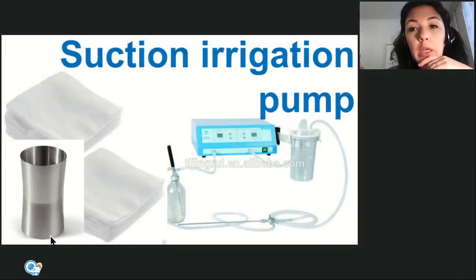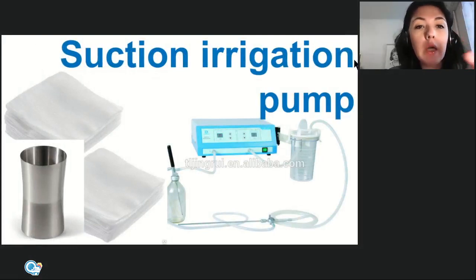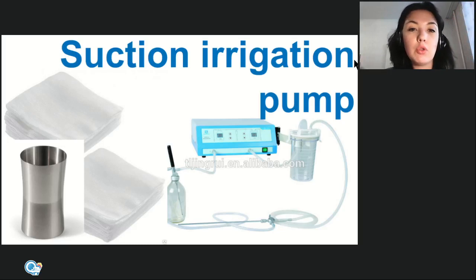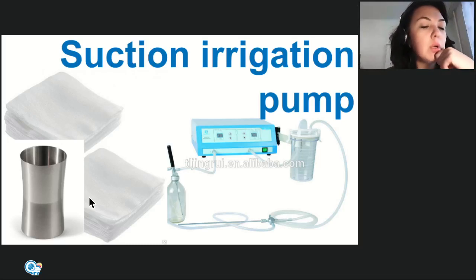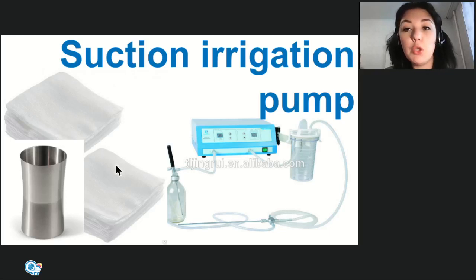Not only the peritoneal cavity, but any cavity where we are performing a surgery. There's a difference between open surgery and minimally invasive surgery in how exactly we wash and dry organs in the cavities. In open surgery, sometimes we just take a sterile glass with a sterile sodium chloride solution, saline solution, pour the solution into the cavity, and then dry it with special cotton tissues.